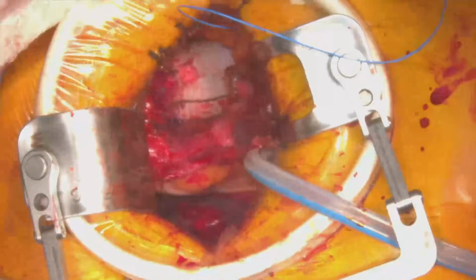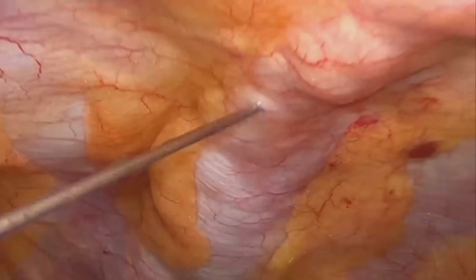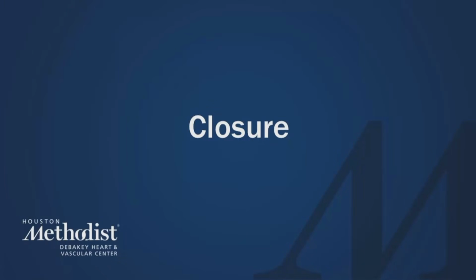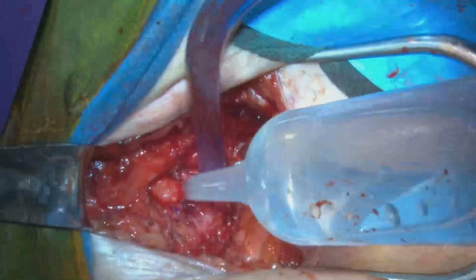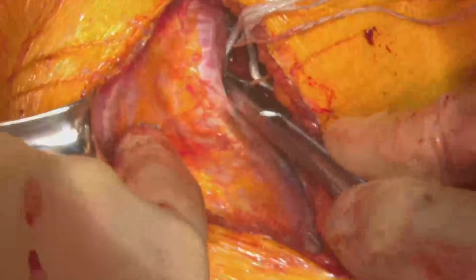Decannulation was then performed in a standard manner. Next, a multi-level nerve block was performed in order to achieve adequate postoperative pain control. The femoral vessels were repaired, and the chest was closed in multiple layers.